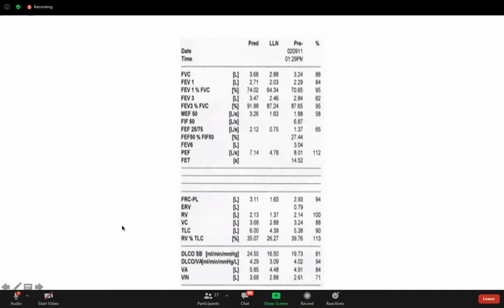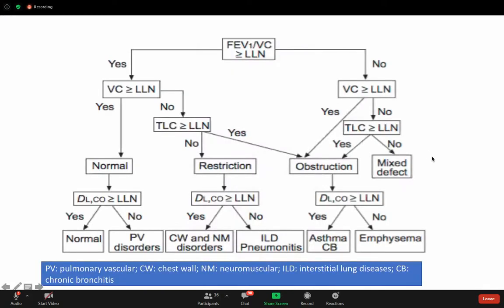A lot of information, but it can be distilled and focused, for non-specialists, to maximum 5 or 6 markers we are looking for. Of course, the others are important, but they are beyond the scope of this lecture and are really for a specialist. So this is the algorithm I was talking to you about.